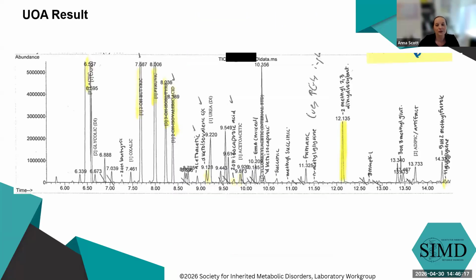And this is what we found. So lactic acidosis, not surprising. That's our big friend over here. Through this middle section, my highlights are really going after an assortment of branch chain intermediates that if we were significantly ketotic, I would be less excited about. Because during ketosis, we're breaking down our branch chain amino acids to access fuel. In this case, there was no ketosis going on. This kid had been on IV fluids and nutritional support.